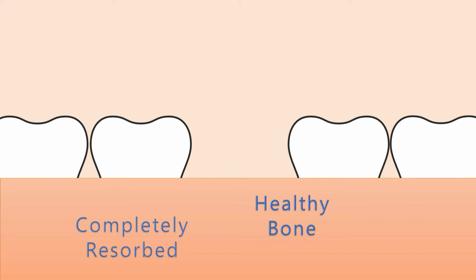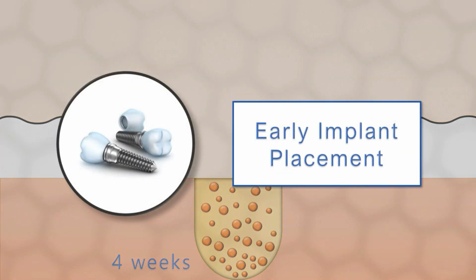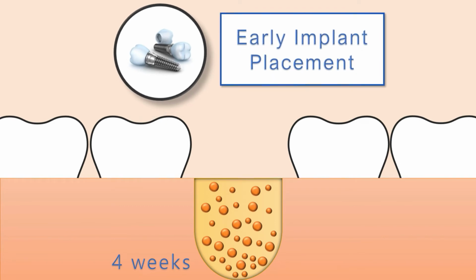Because the osteoblasts are proliferating and secreting osteoid as soon as 4 weeks, early implant placement is not only possible, but ideal for achieving optimal bone-to-implant integration. The reason for the success of the early implant technique is due to high numbers of stimulated osteoblasts found at 4 weeks. The primary source of osteoblasts is at the apex of the socket, which is why bone mineralizes from the apex to the crest.